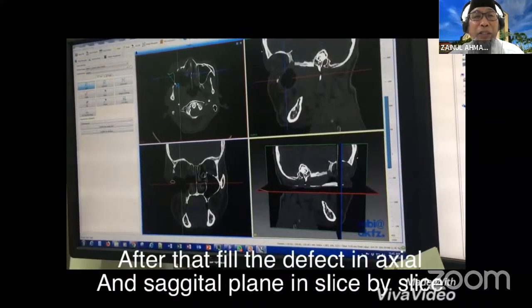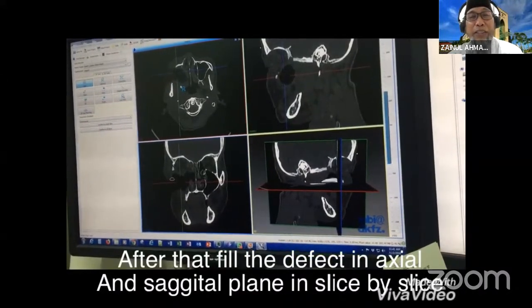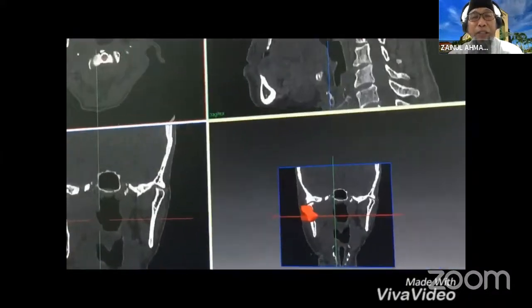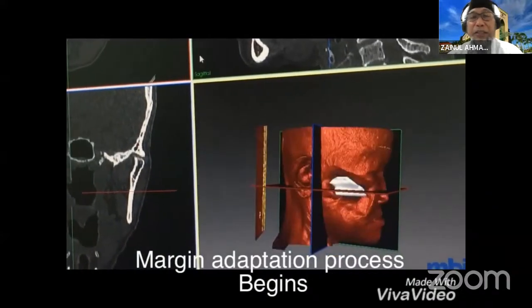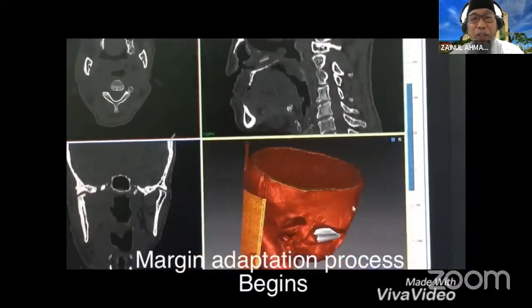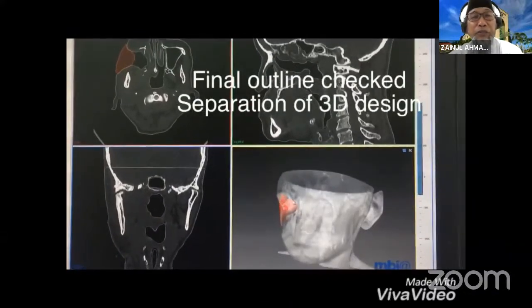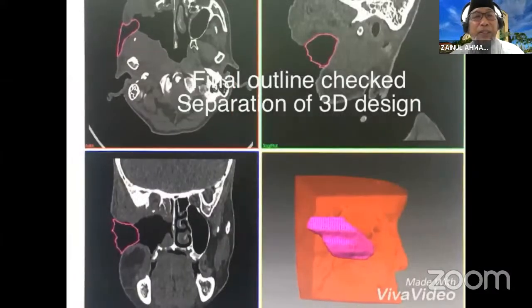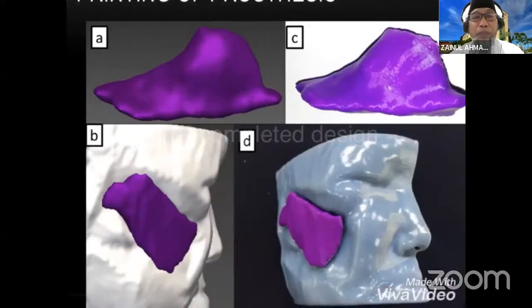You have to go a little bit downward with regards to the axial view you are working from, but you can see from the sagittal view which area you are working on. So it must be very meticulous. It must be slice to slice data, just to make sure that all are filled. You can refer to the axial view on your left, where the extent of the process that you are putting in is. Then you have a complete design.